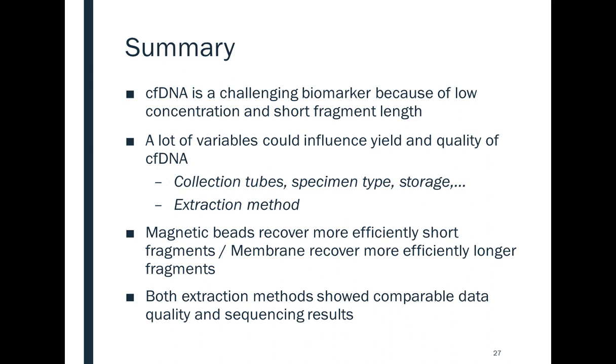but we know that there are certain mutations at certain positions, and then we could normalize or train our bioinformatic pipeline. For the Illumina, this sequencing is better compared to the Ion Torrent analysis, but the non-systematic errors are difficult to define as artifacts, because we are going down to really low allele frequencies. So 0.1% is really challenging. But there are also some techniques using unique molecular identifiers with Illumina sequencing. In our lab, we have both platforms. For this, we use Ion Torrent.